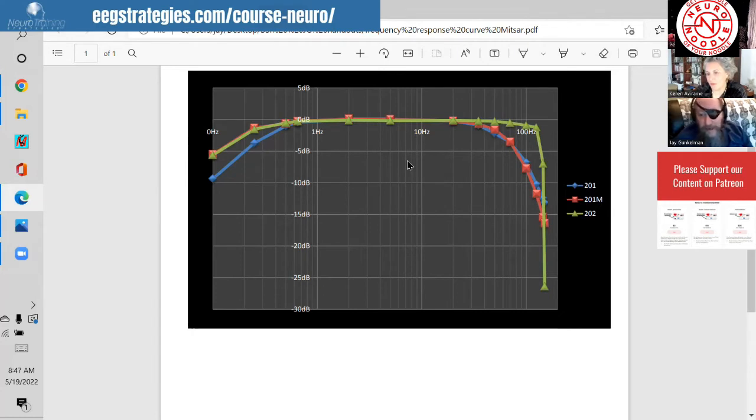Now, not every other country is going to have those same differentiations. Ultimately, they're a little bit arbitrary. A device that's intended for neurofeedback could just as easily be a diagnostic device. It's just a matter of what they file for. But the FDA filing ends up changing what it looks like if I have to go to court with it. And having been in traditional medical interpretation, court's just half a step away half the time. And somehow I made it through 50 years with no litigation.